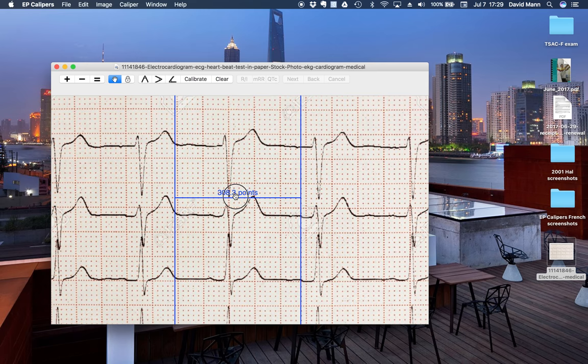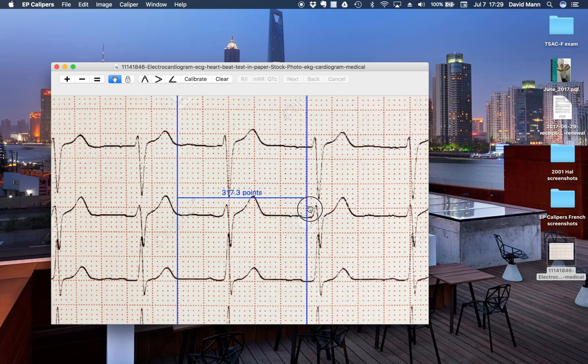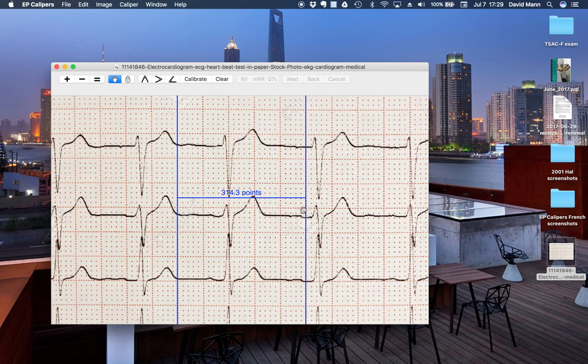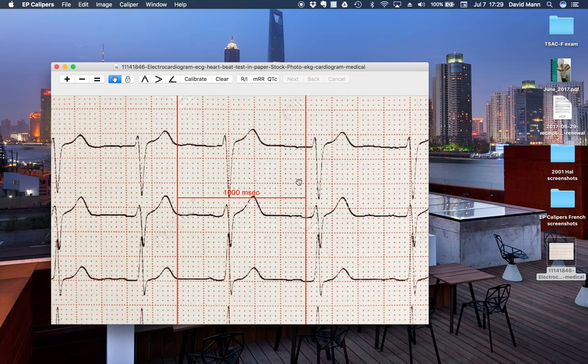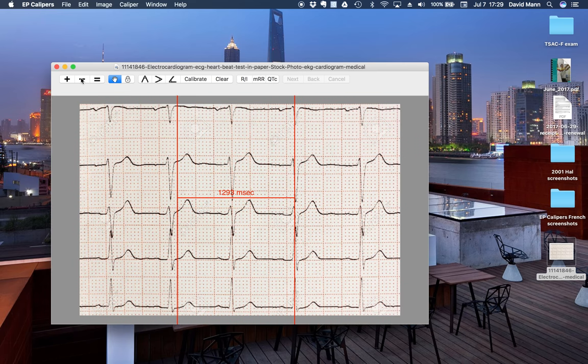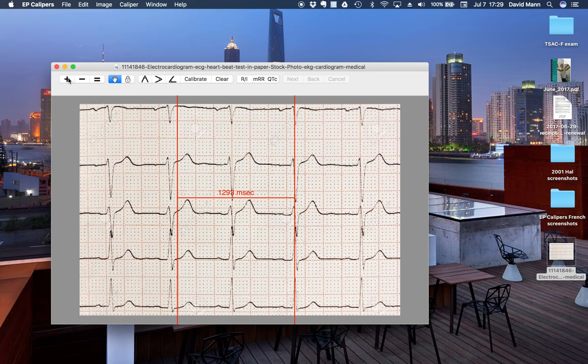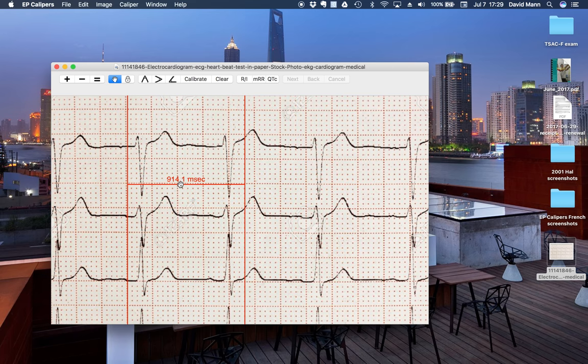We won't do this accurately, but we'll make a quick calibration on this caliper, 1,000 milliseconds. And of course, make your measurements. And as you change the zoom, the calibration stays intact and is accurate.